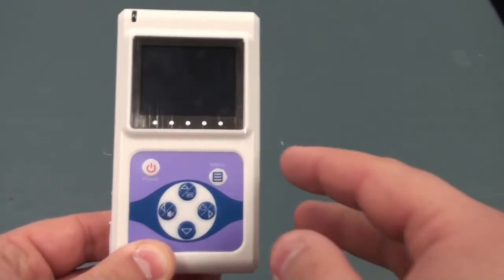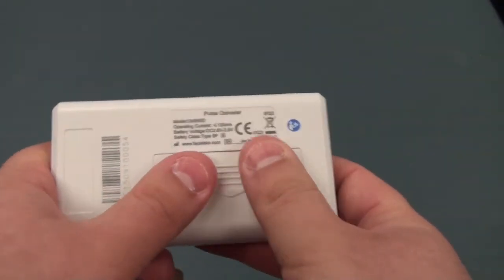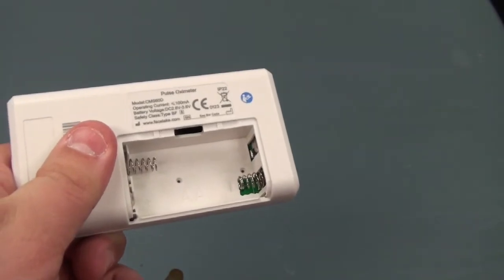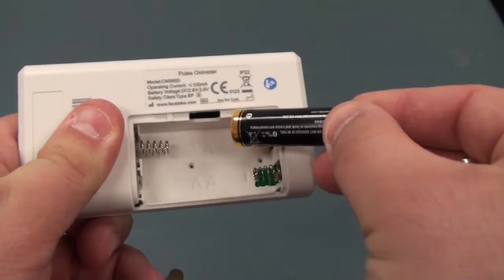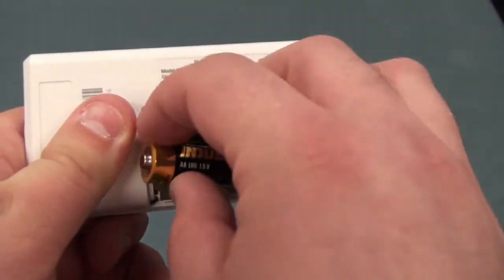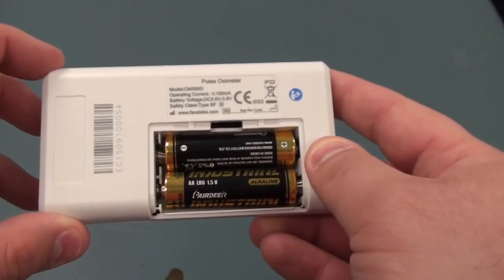To install the batteries, simply flip the device over and open the battery cover. Once the battery cover is open, follow the directed position of the batteries and close up the back cover.